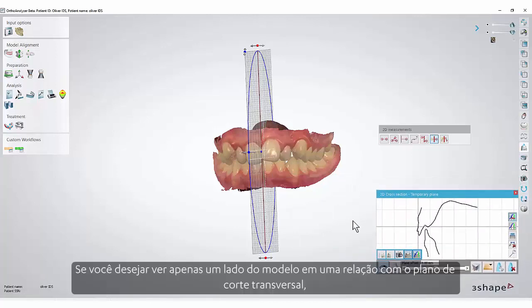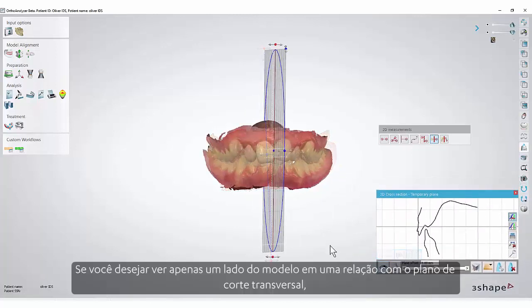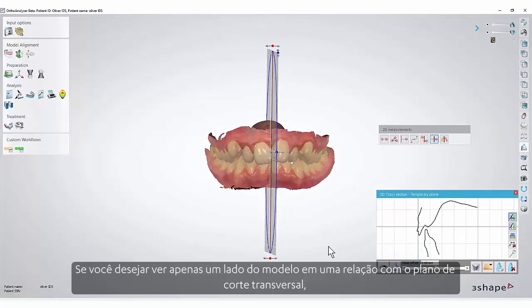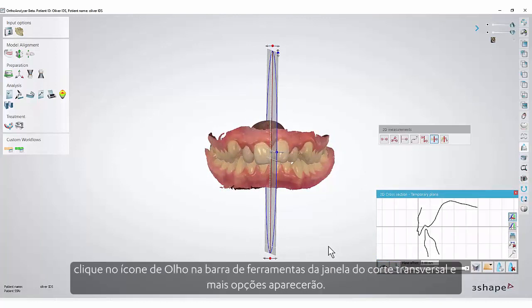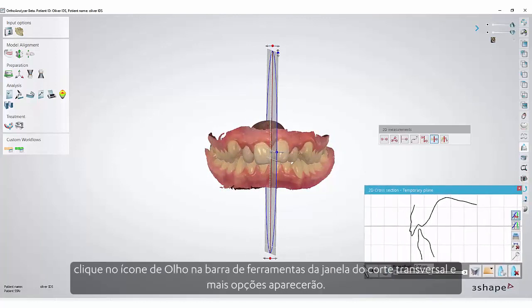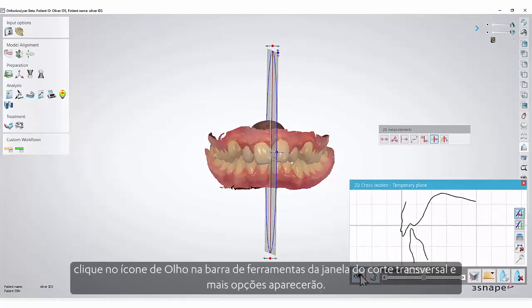If you wish to see only one side of the model in relation to the cross-section plane, click the eye icon in the cross-section window toolbar and more options will appear.